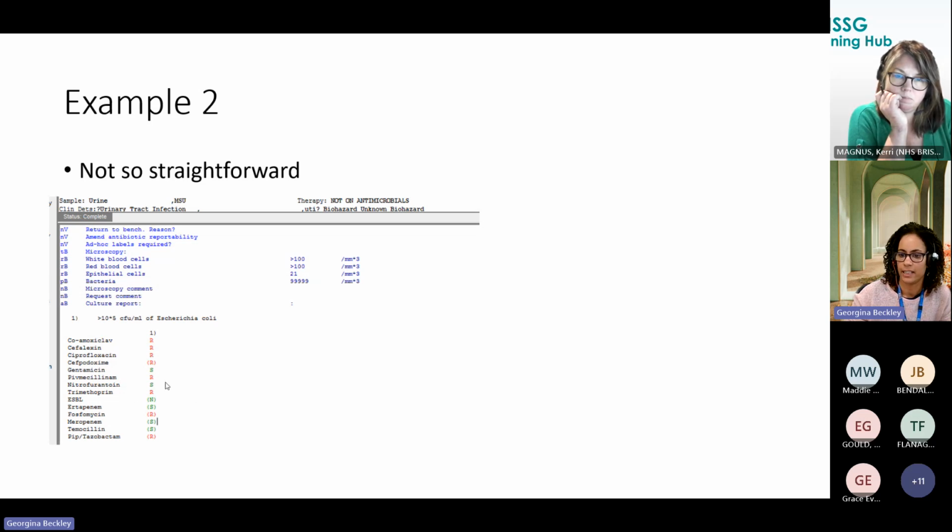So this one, if they had renal impairment, you'd probably be calling us up for other antimicrobial options, and we'd be trying to explain that unfortunately there aren't any other oral options for pyelonephritis. So it might be that they had to come into hospital for intravenous antibiotics. But the minutiae of that doesn't really matter. It's more giving our thought patterns when we're validating this, and how important clinical details are as well for our interpretation to provide a useful report for you.